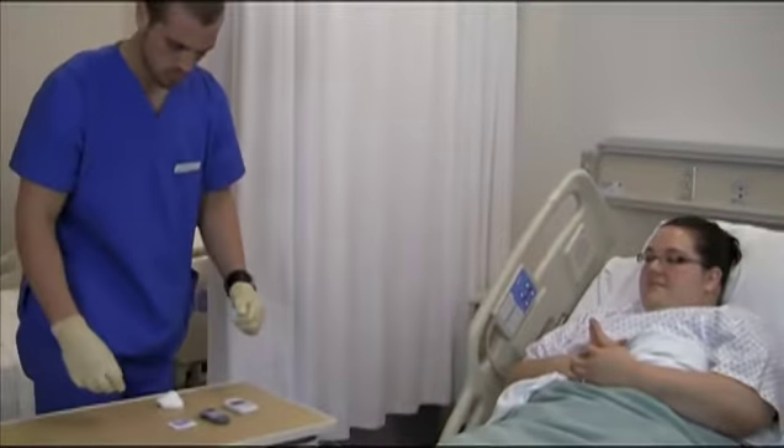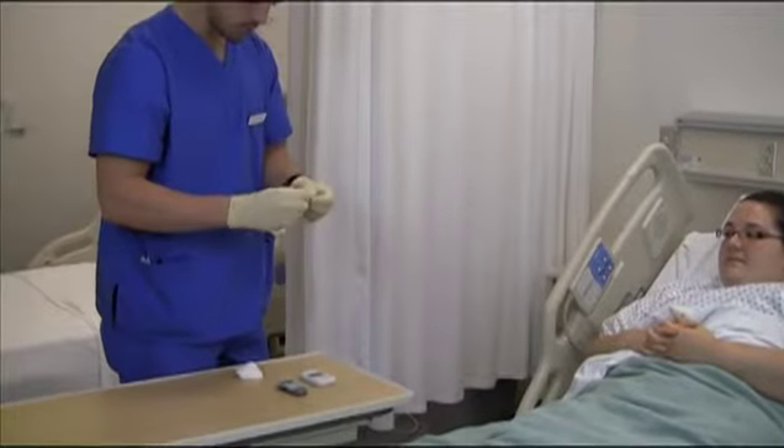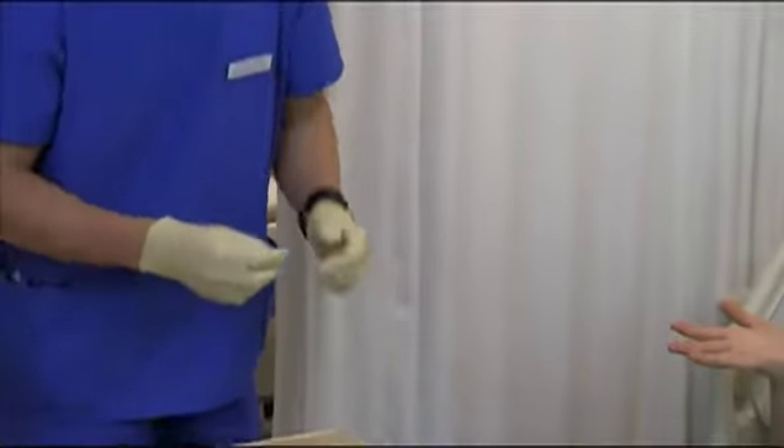Assemble the equipment and supplies based on agency protocol. Test the glucose monitoring machine for accuracy, if necessary.